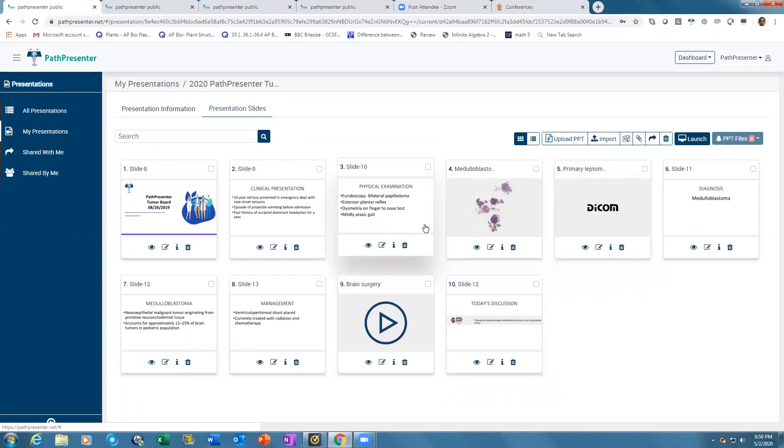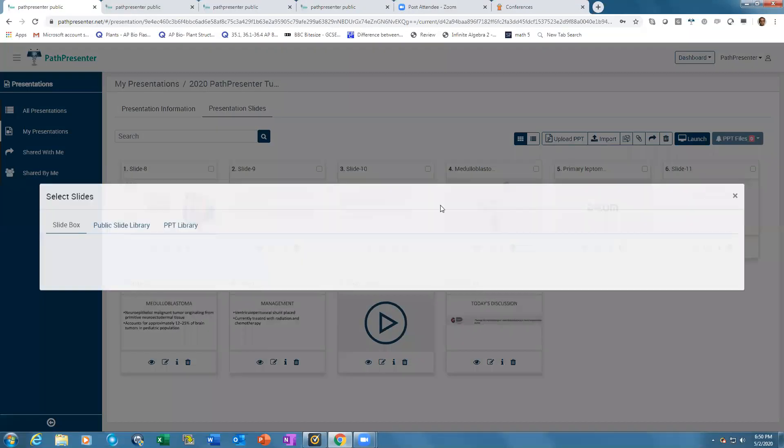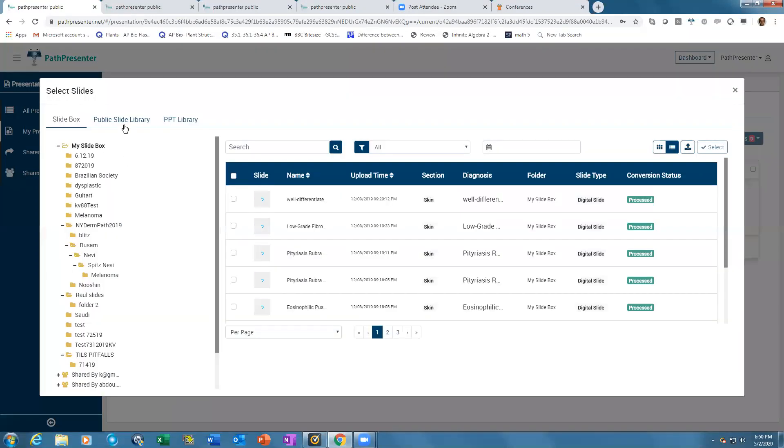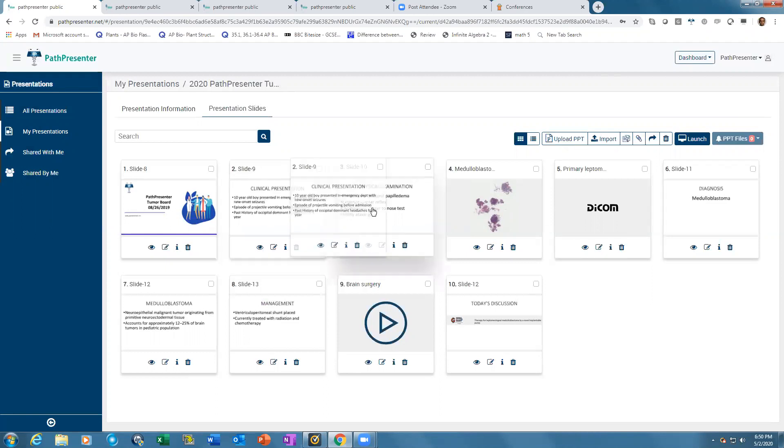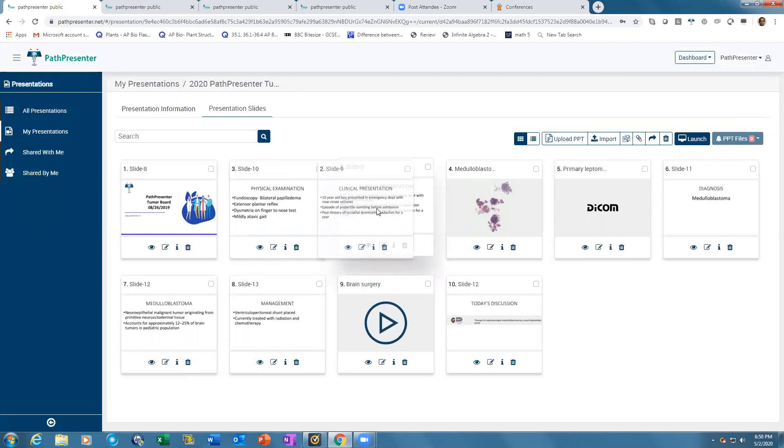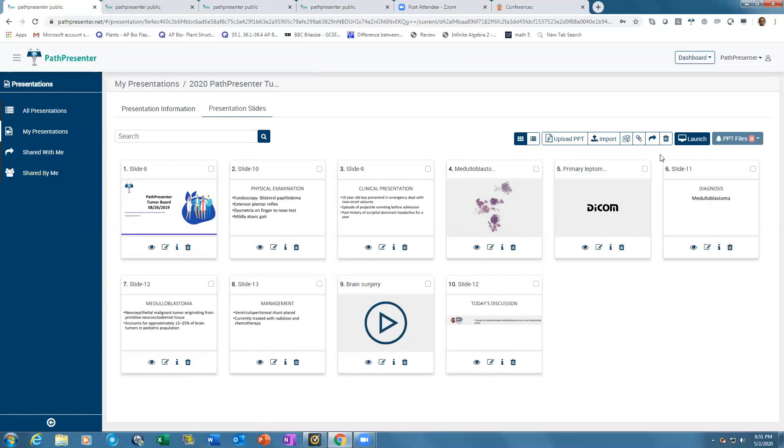To import any slide, click import and select from the public library or your own slide box. To upload PowerPoint, just upload from your desktop. Once your slides and PowerPoint are in, drag and drop them in whichever order you want. You can share this presentation with anybody around the world and use different annotation tools when presenting.